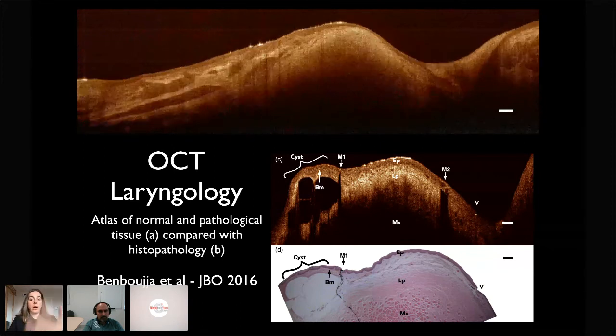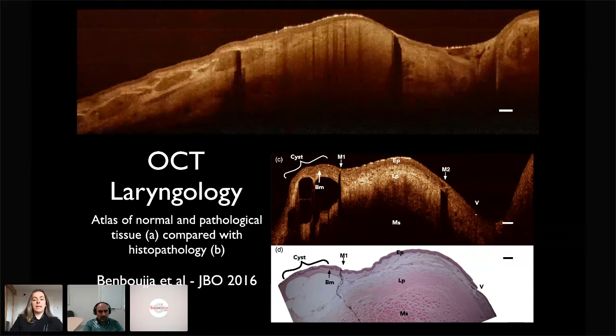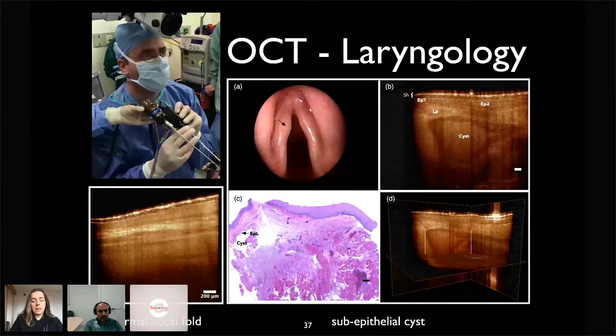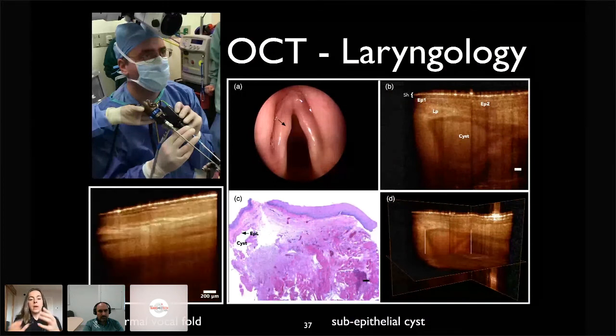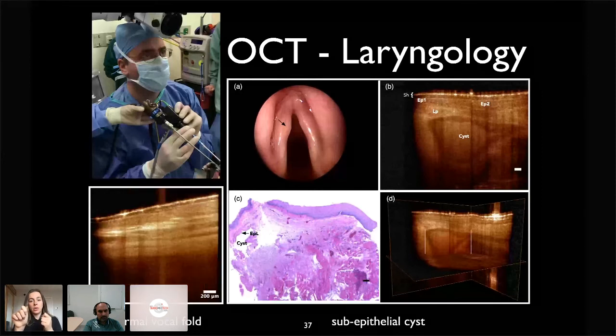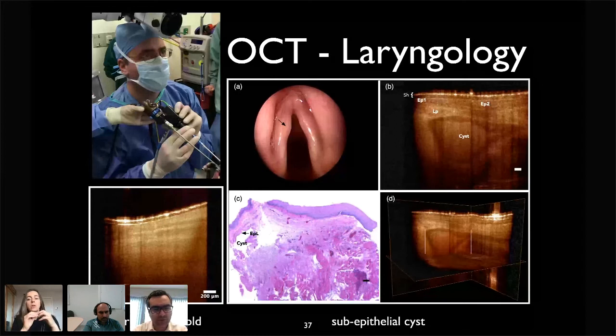Of course, bringing color to that is one avenue. But another avenue is: what do you do once you diagnose a pathology? And again, I want to stress the importance of OCT. In A, you have the endoscopic vision of the vocal folds, and the arrow points at a bump. The current way to diagnose is essentially to touch it with a long device and try, through mechanical properties, to assess: is this as stiff as a nodule or a cyst?